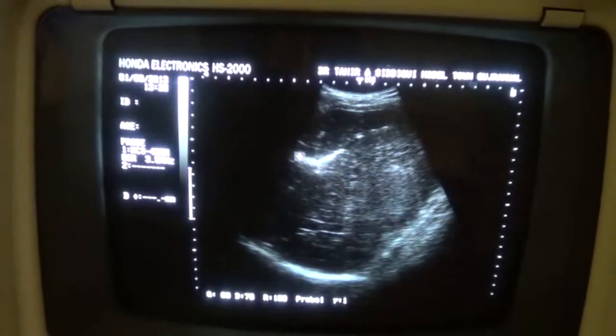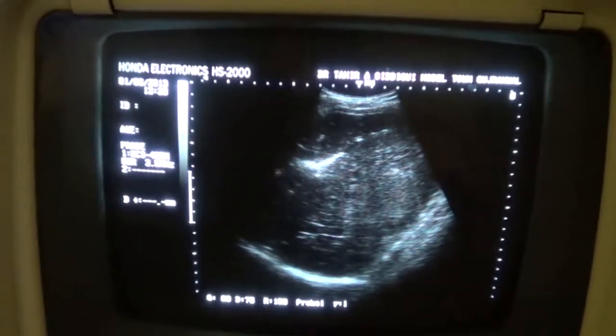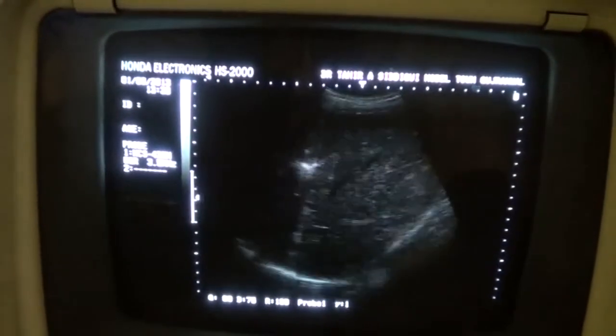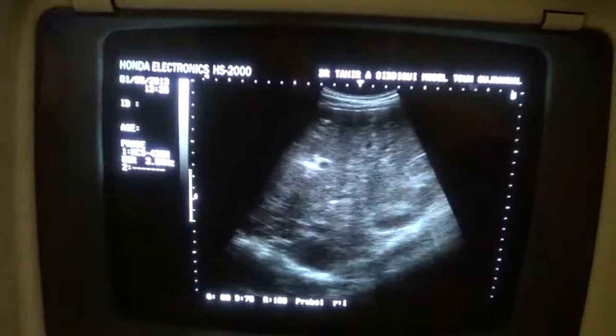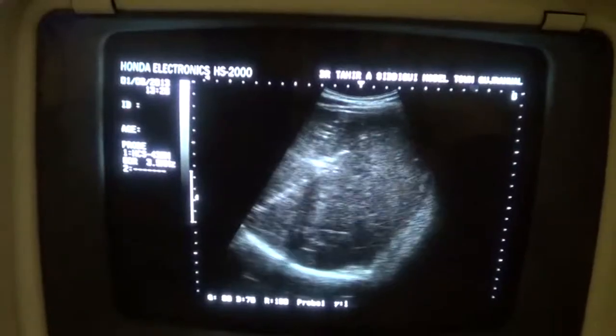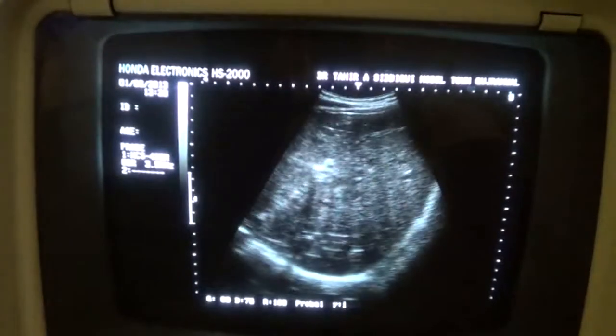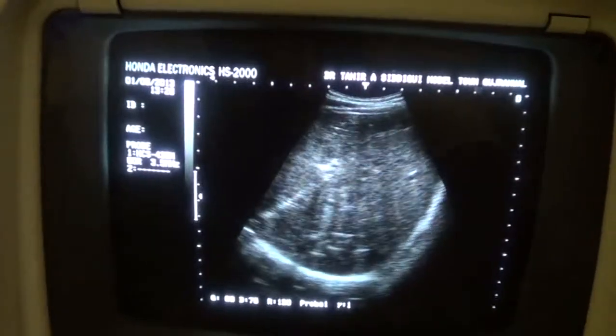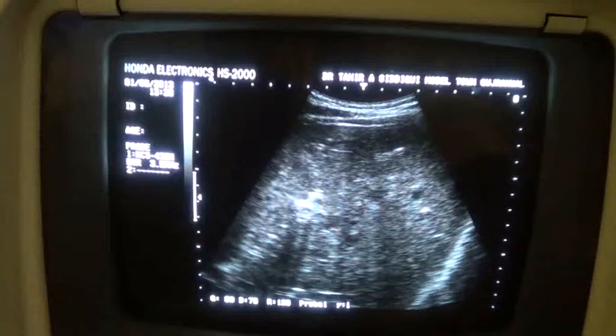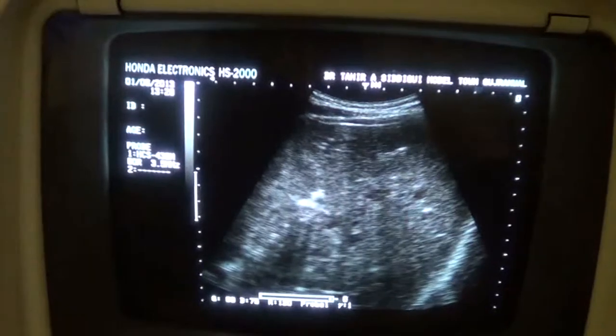In fact, the air is in the biliary tree. The biliary tree is not dilated — these are portal vein radicals.